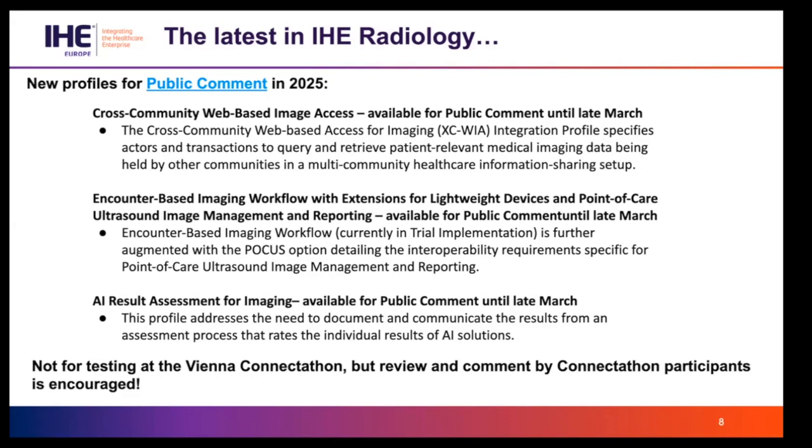That very large area in imaging has its very specific interoperability requirements in image management and reporting. It introduces a couple of new actors to this profile and has been met with very large interest from the industry group and also from the users. There was a very large working group working on defining the profile, which helped the IHE committee to draft what we have right now.